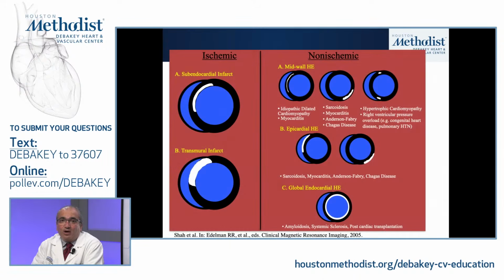But again, I want to finish off by coming back to this slide right here, which shows the different patterns of delayed enhancement that occur after gadolinium contrast. And again, to point out that in the setting of ischemic heart disease, you have a subendocardial or transmural pattern, but in the setting of non-ischemic heart disease, there are a variety of different patterns, and there are patterns that will help you to generate a differential diagnosis, whether it's mid-myocardial, epicardial, an RV predilection site, or a very global subendocardial pattern.